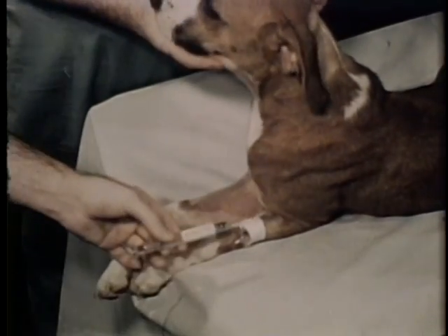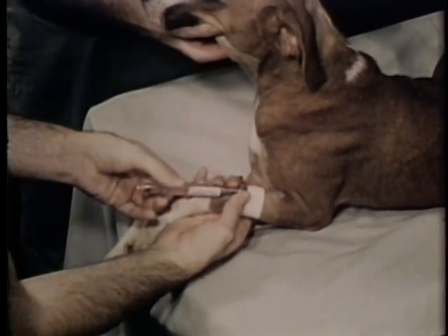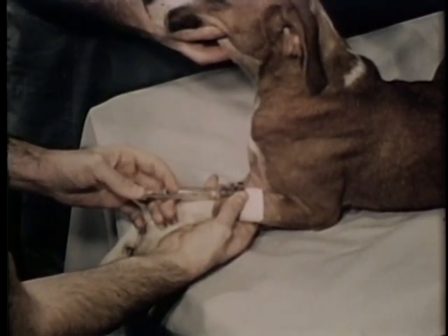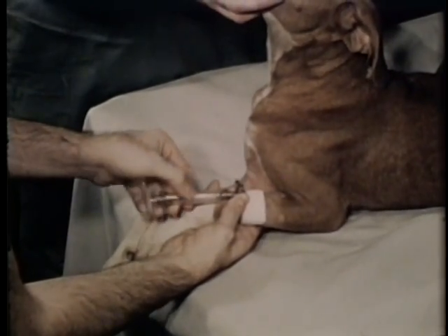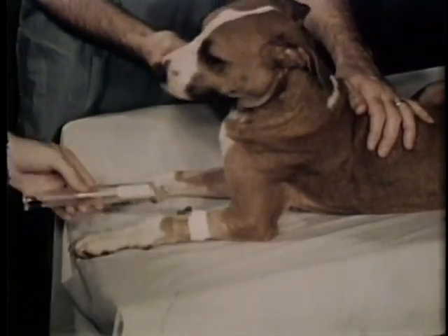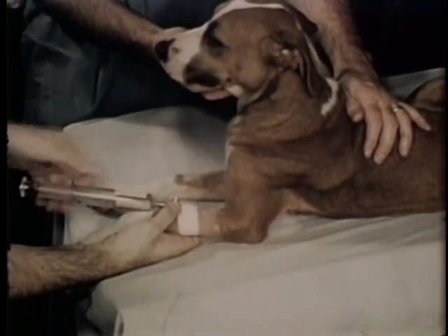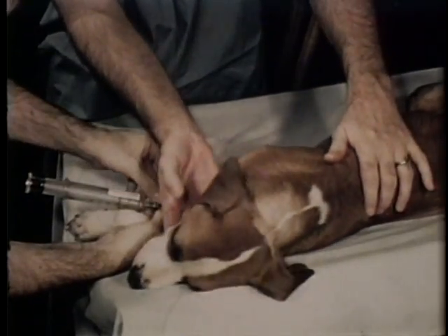Anesthesia of the animal is designed so that a minimum of barbiturate is required. Atropine, 4/10 of a milligram, is first administered. Through the intravenous needle, 10 milligrams per kilogram of pentothal are administered to induce anesthesia. During the next 20 minutes, the animal will receive another 10 milligrams per kilogram. After that time, no more pentothal will be given.